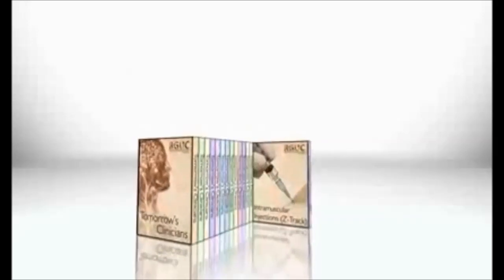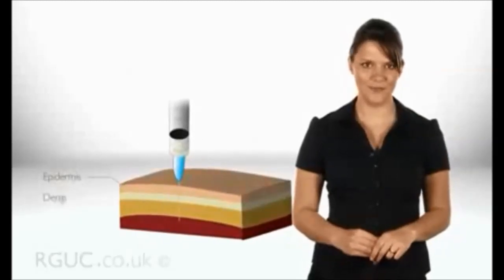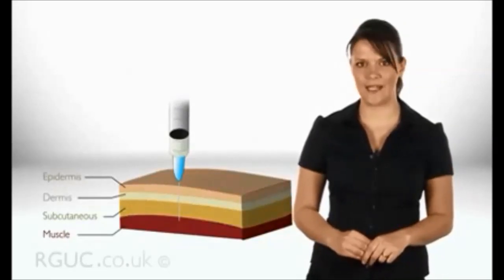In this episode of Tomorrow's Clinicians, we'll be looking at the procedure of administering an intramuscular injection using the Z-track technique. An intramuscular injection deposits medication into well-perfused muscle tissue. The vascularity of muscle aids rapid absorption of the medication into the systemic circulation.